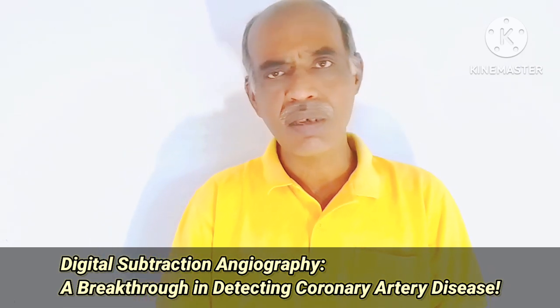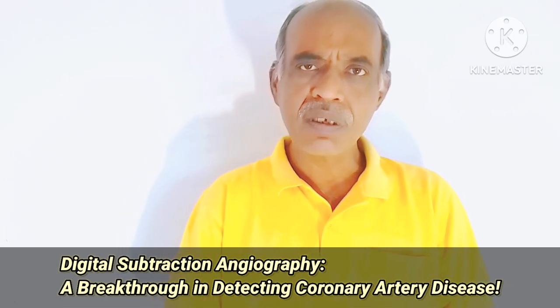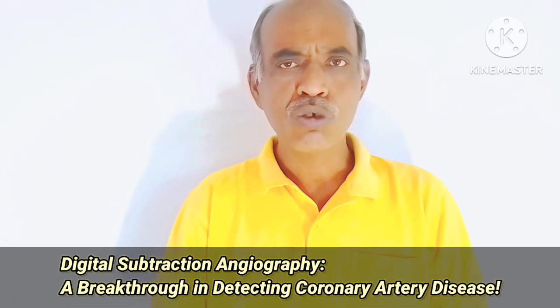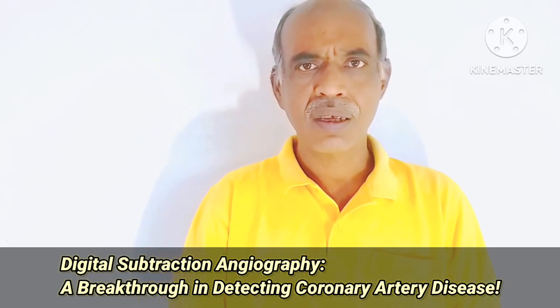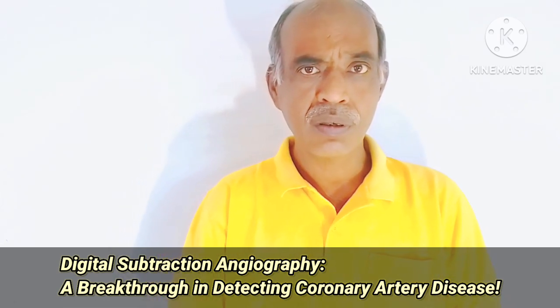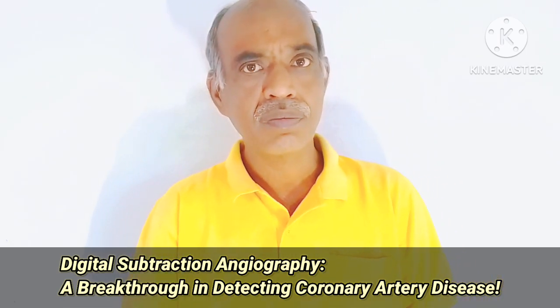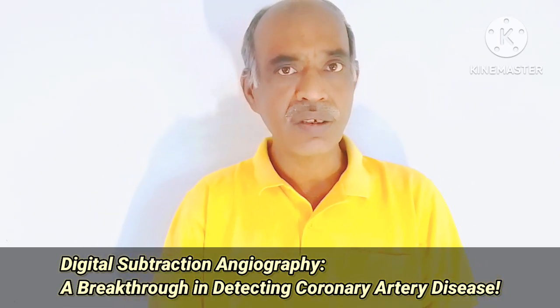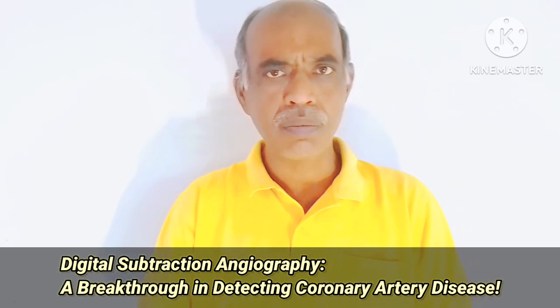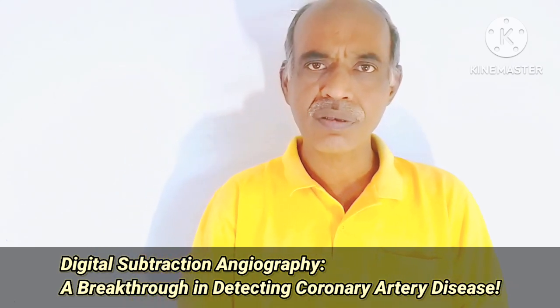In the first image, blood vessels, bones and soft tissues were all present. If you subtract this way, then in the final image only blood vessels are visible. That means the image becomes clear, and you also get a higher resolution image. Diagnosing the problem becomes easier and more accurate for the doctors.